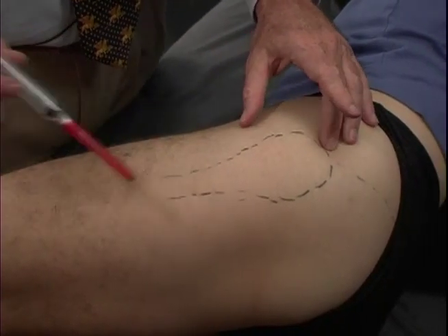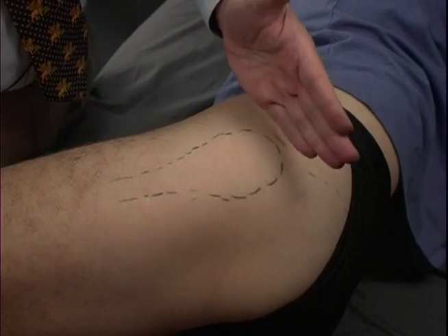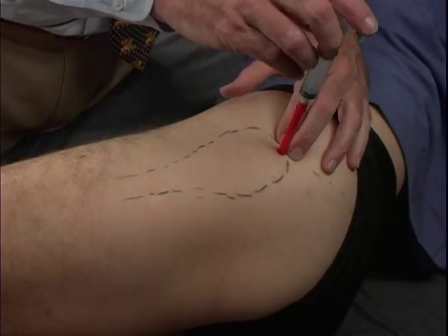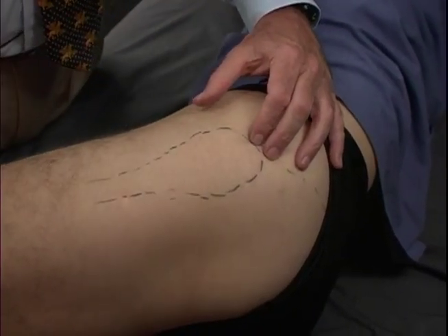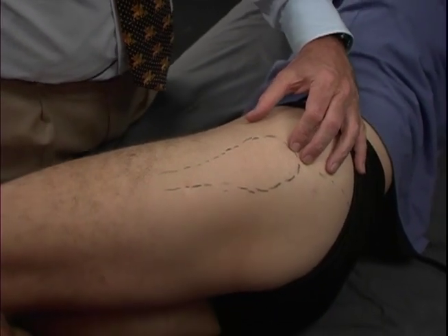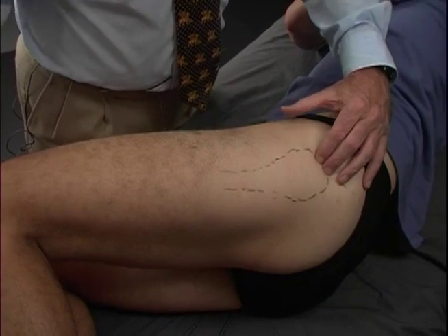This is a convenient position also to do our intra-articular injections, and once we found the top of the trochanter with our needle and done the injections in this area, with the legs slightly elevated at the knee with a pillow between the knees, this elevates the leg like this and makes it easier to enter the joint.